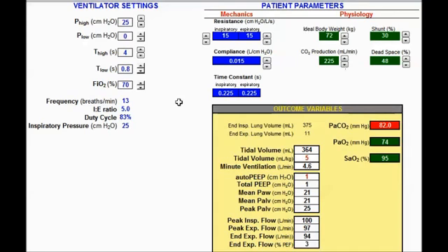And as you notice, this is kind of more precise. I can target my tidal volume and still look at my auto PEEP. I'm still in a safe range here. And I really haven't affected my tidal volume very much, but it gives me a wider range, a more precise, kind of easier way to set T-low.